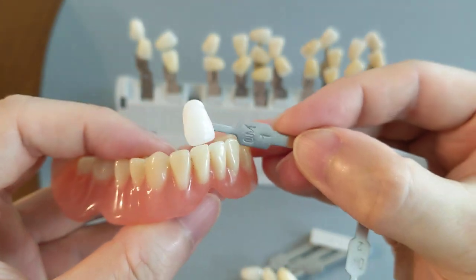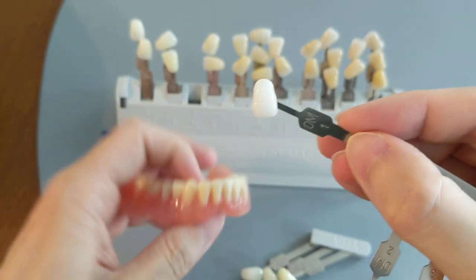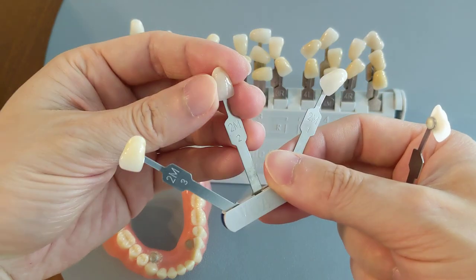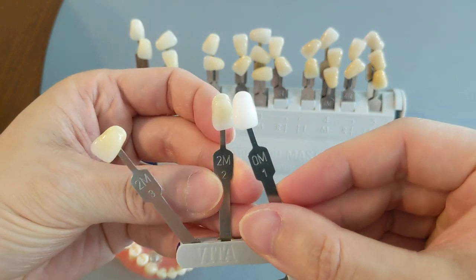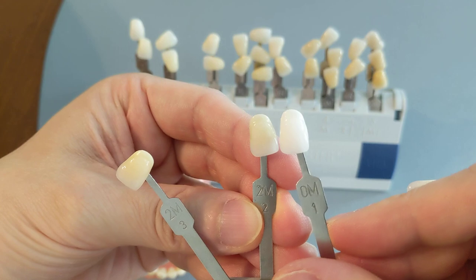Just going to show you all around. Hopefully that gives you a good idea of what it looks like. I can compare them to the tooth tabs here as well. So we have the 0M1 next to the 2M2, and as you can see, it's quite a bit whiter.